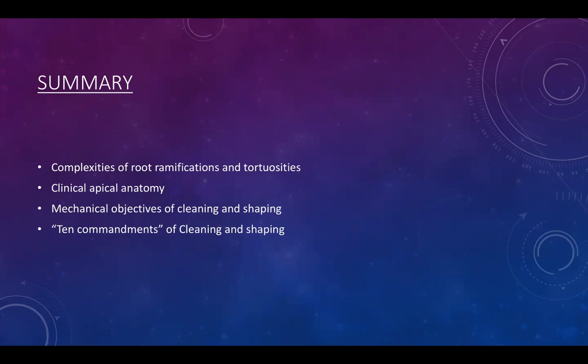Sometimes during the preparation we have to go in manually with hand files to make sure, like I said, that we don't have any debris blocking the canal and that I haven't lost my working length. It is very important to have a very sound reference point, and to have the pliers, and make sure that before I take that x-ray, my cone is going all the way in.